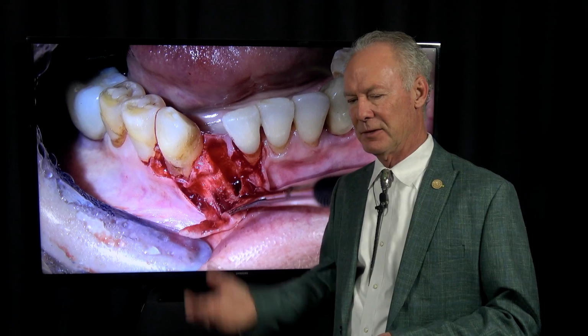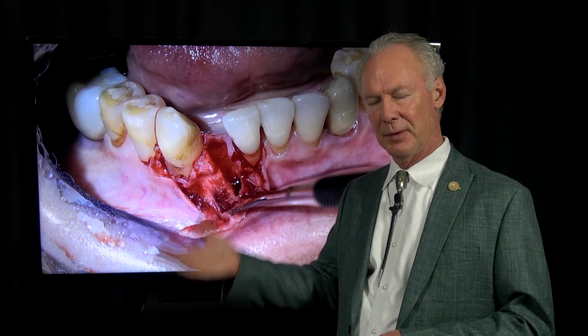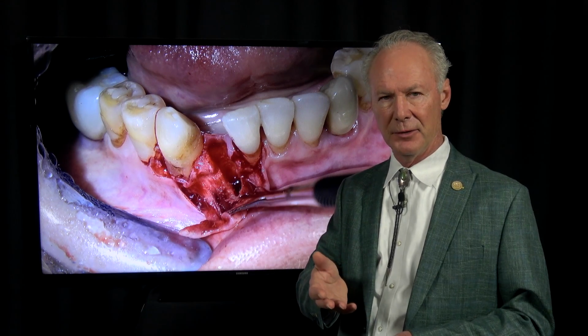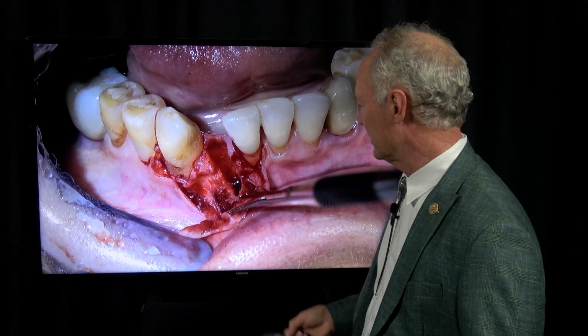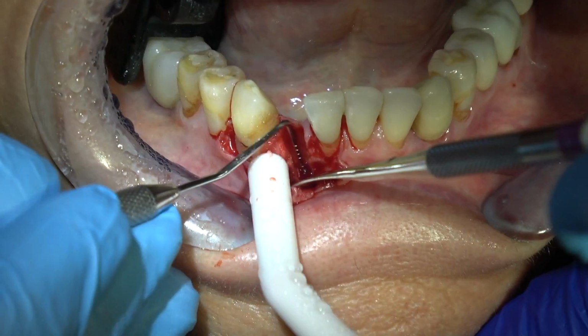So I'll go through that again. If it's a multi-rooted tooth like a molar or a multi-rooted bicuspid, sometimes you can place the implant at the time of extraction with a 2-rooted bicuspid. If it's a multi-rooted molar, I personally always graft the socket with either platelet-rich fibrin and freeze-dried bone, or sometimes I'll just use freeze-dried bone if the patient doesn't have good veins and you can't draw blood easily to fabricate platelet-rich fibrin. Then once I graft the socket, I'm going to let the bone heal for at least 3 months and then come back and place the implant.